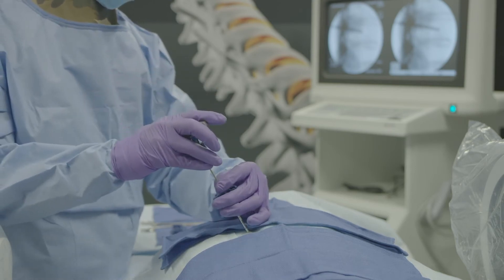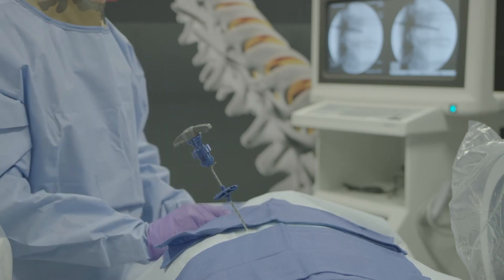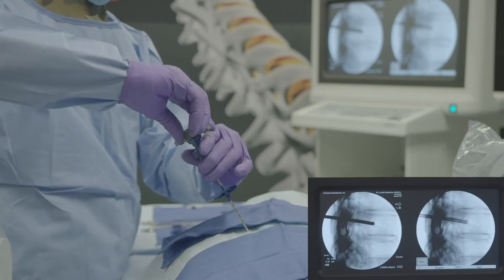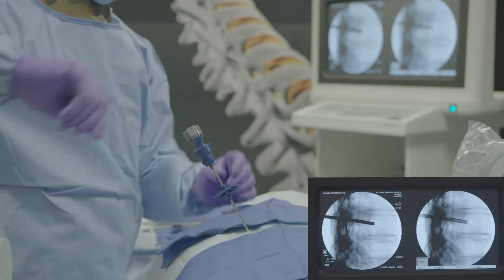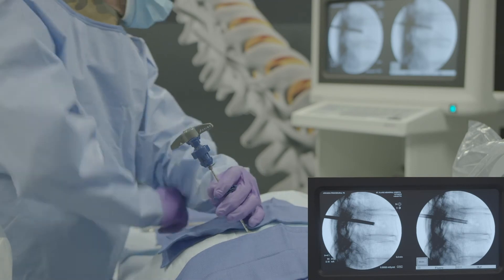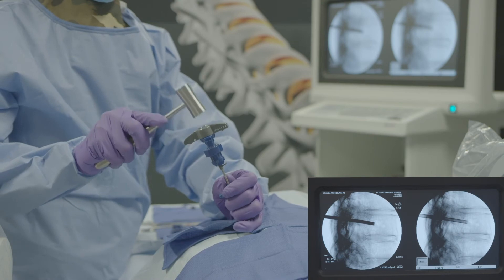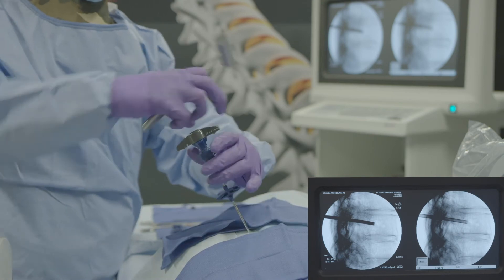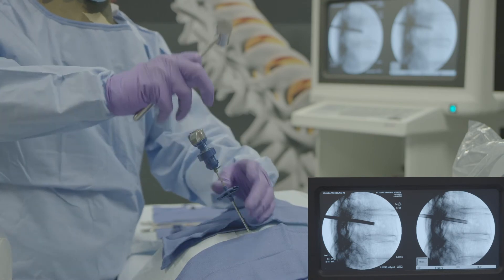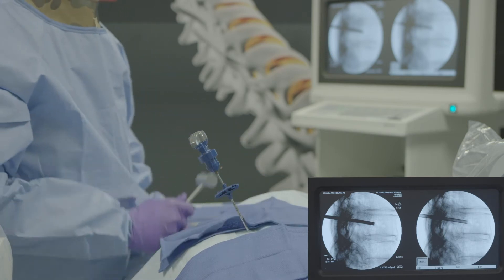Advance to the first laser mark on the shaft. The power curve distal tip will be flush with the distal tip of the working cannula. In the lateral view, advance the power curve navigating osteotome to the next laser marking and rotate the deployment handle in a clockwise direction to articulate the tip.